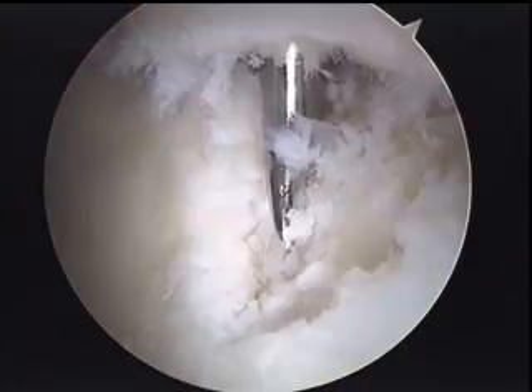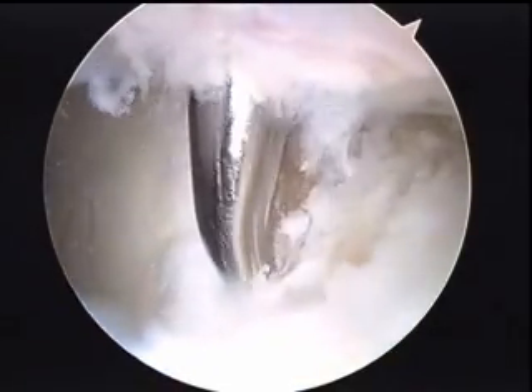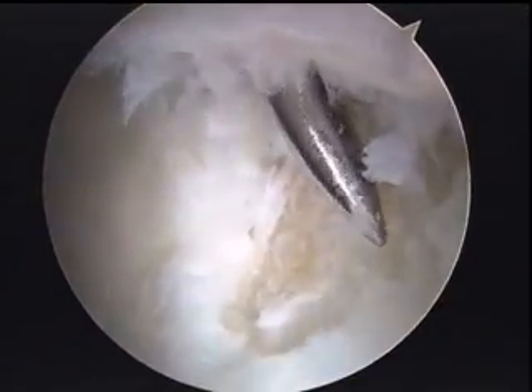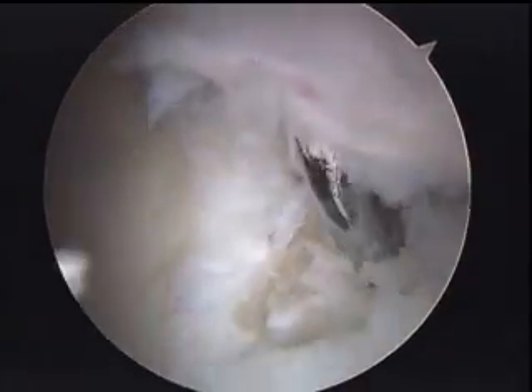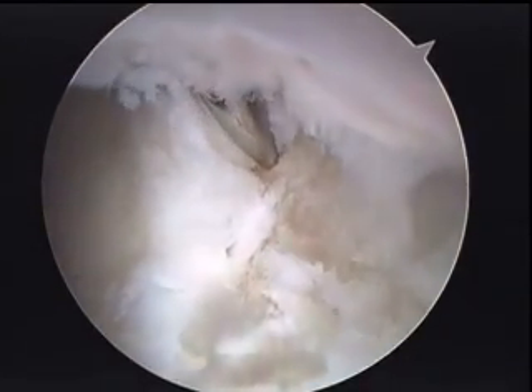There we can see that defect. Now we've established another portal and are doing the microfracture of that osteochondral defect where the delamination of the cartilage was that we resected. This is a sharp tool making some holes into the bone trying to stimulate some bleeding in this area. Hopefully that bleeding will bring some fibrocartilage into the area to fill up this void and give him some more articulating surface for his hip.